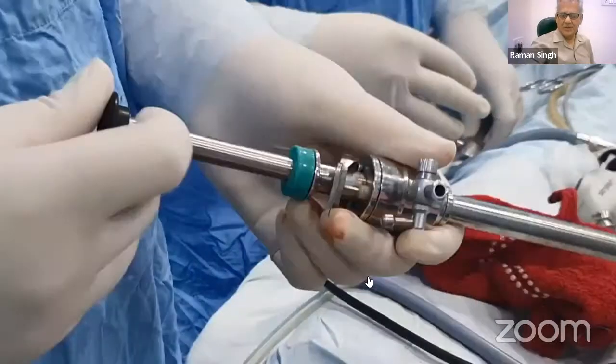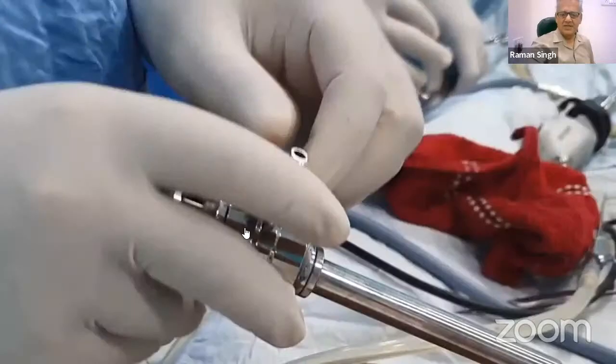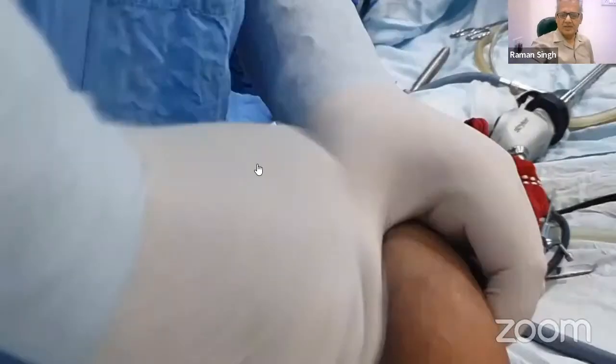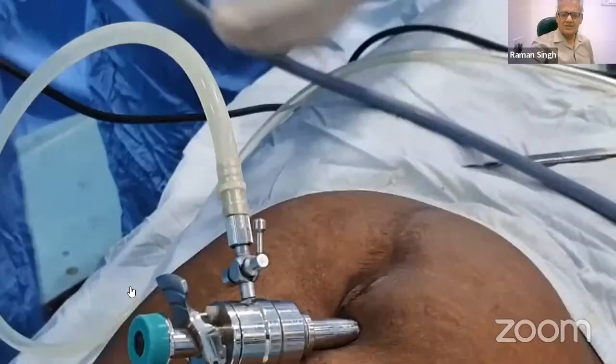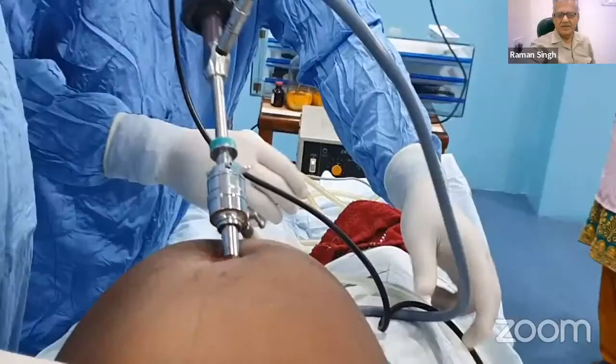After creating pneumoperitoneum, this first port is created by pushing a 10 mm cannula inside the abdomen, holding the abdominal wall and pushing the trocar toward the pelvis, where there is no structure, presuming that there is no structure which can be damaged. Then this diagnostic procedure is performed. Now pneumoperitoneum is created, camera is in.